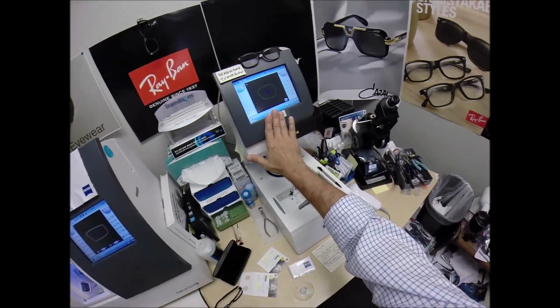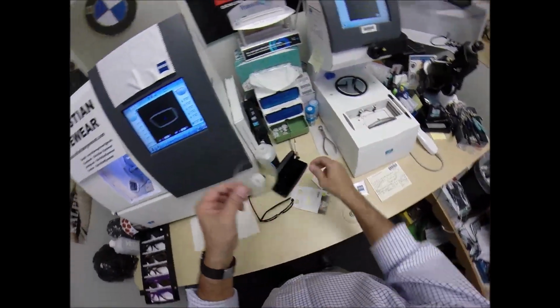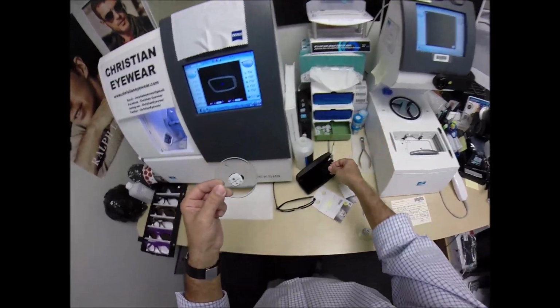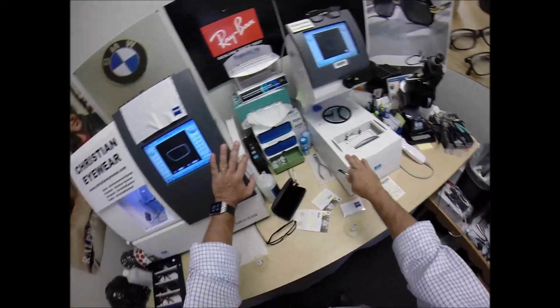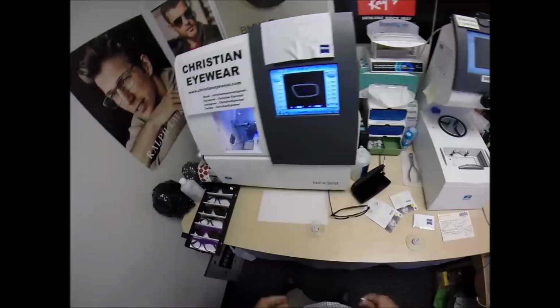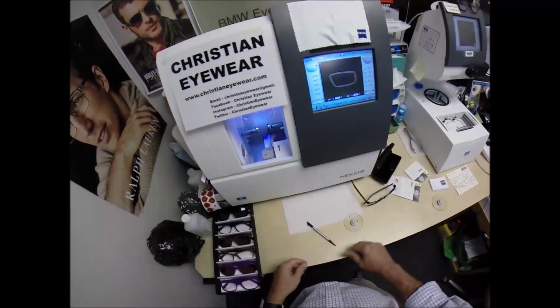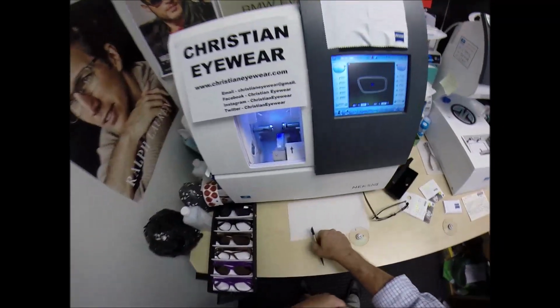So this is the blocker, this is the tracer, this is what's known as the edger. This is what's going to edge the lens down till it's this size. This wheel in the center, by the way, this costs $40,000, the whole setup. It weighs 200 pounds. I recommend everyone go out, buy their own, put it on your kitchen counter. Then you can cut your own lenses at home, and you won't need this guy with the two thumbs and the bad jokes to cut them for you.